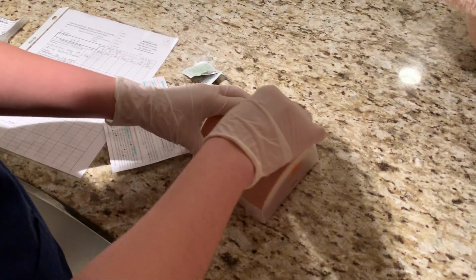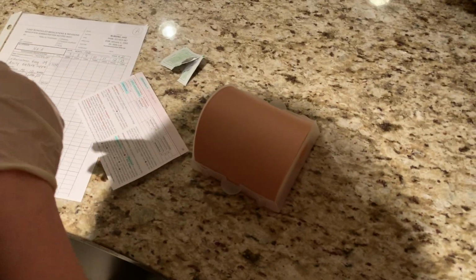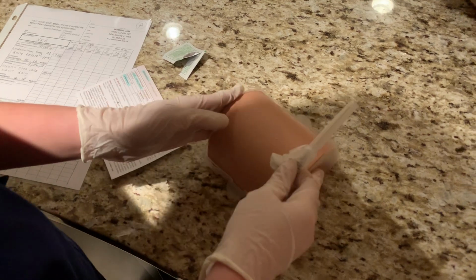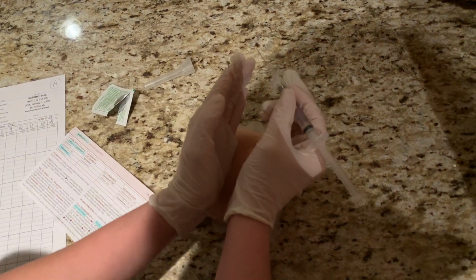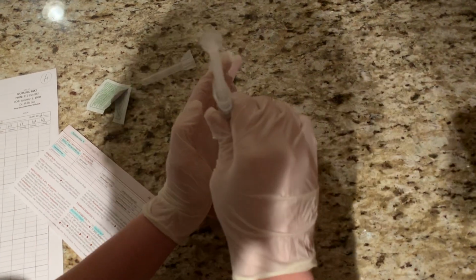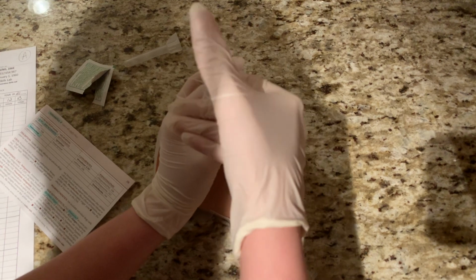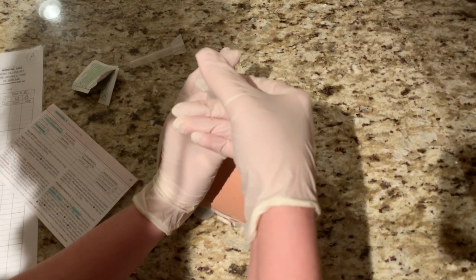Okay, Jake, this is going to be a needle. The site that I'm working at does not require me to aspirate, so I'm not going to do that. So I would pull the cap off, Z-track to the side, inject at a 90-degree angle, stabilize, and then inject the medication slowly.